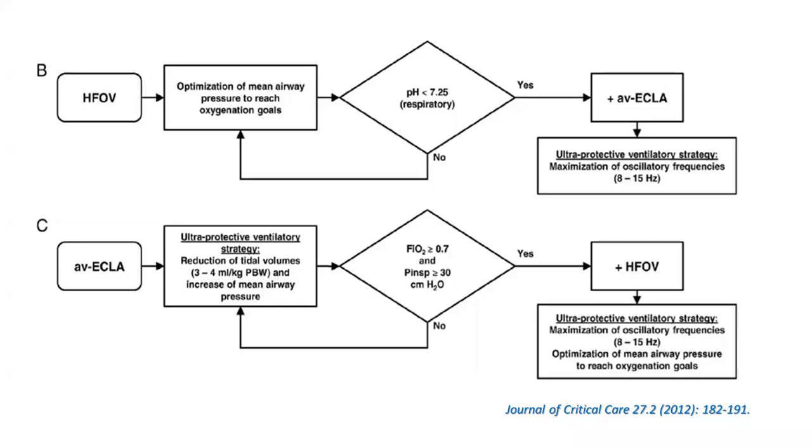I never use it for a patient with a failing heart who has lung edema. I prefer to go to ECMO and rest the lungs rather than keep him on high frequency. At least if you have a Dräger, you can shift the patient from conventional to high frequency and see if the patient improves the hypoxia. But most of our hypoxia is because of shunt lesions or residual lesions, not lung disease, unless you have reperfusion injury. So maybe ECMO is safer in these patients.